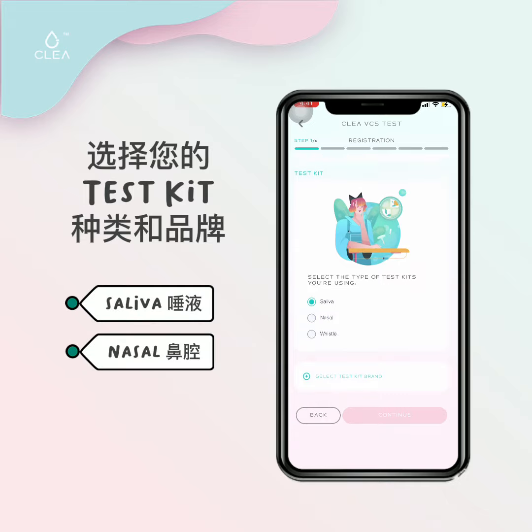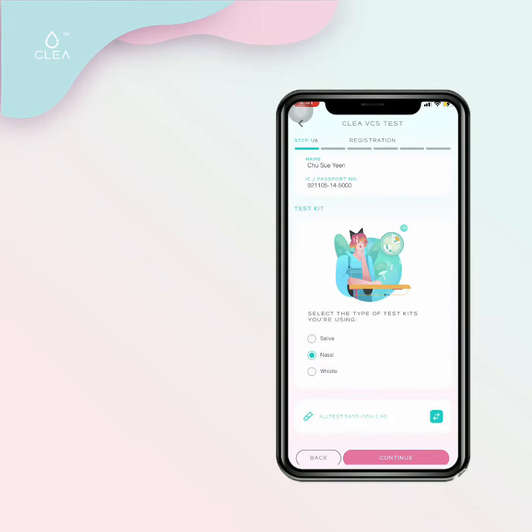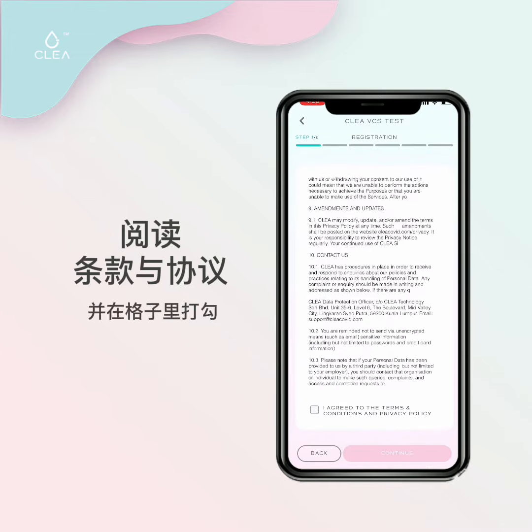Select the brand of your MDA approved test kit, then click continue. Read through the terms and conditions, tick on the box, and continue.